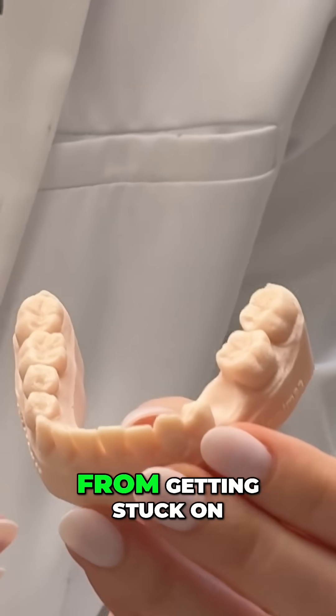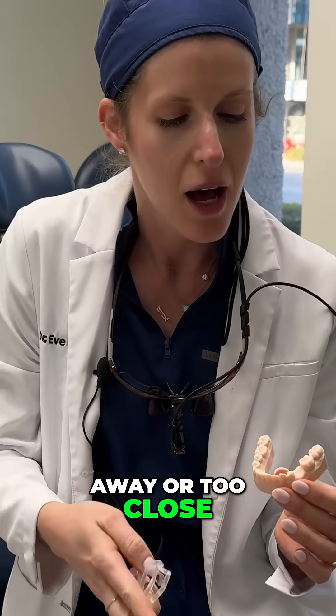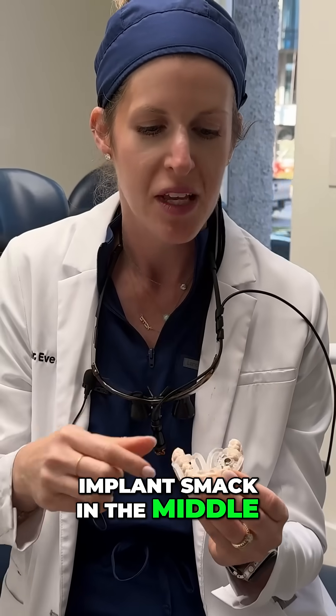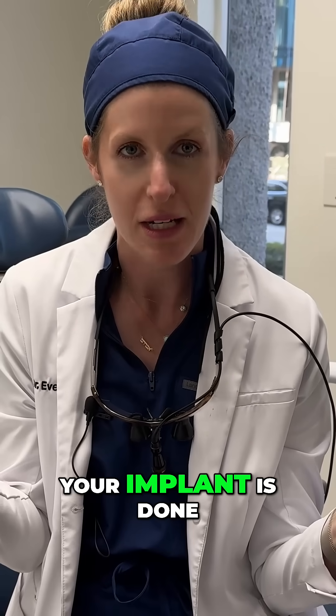It helps avoid food from getting stuck on one side because it's a little too far away or too close, and it really allows us to almost eliminate the possibility of human error by placing the implant smack in the middle. So we just place it through this little hole and boom, your implant is done.